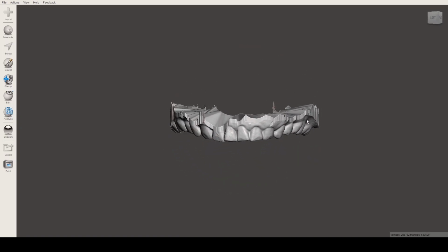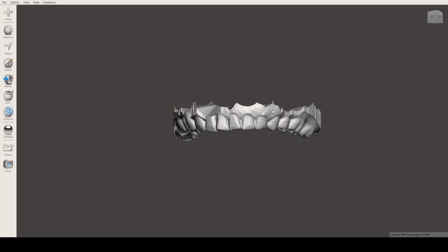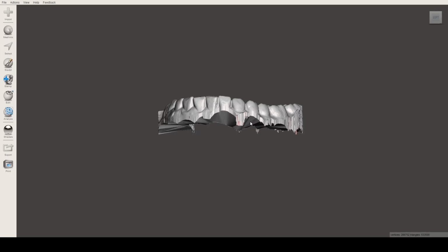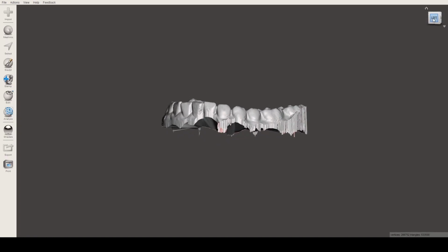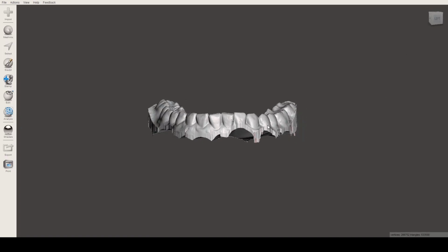Wait. Actually, this is the lower tooth. You know what? Let's transform it one time. I'll just skip to the part, okay? Okay. This is how far I've got, and there's not much. Well, I just rotated it 360 and pointed it because I realized it's the bottom part of the teeth. Anyway, this is our left part, so this should serve as our front. Well, it's actually much better than earlier. The fact that it's no longer inverted makes it better.